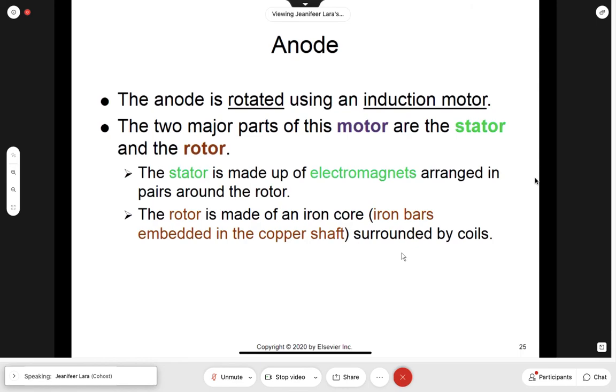So it's considered a part of the tube and also the housing, am I right? No, the x-ray tube port or the window sits inside of the housing. So I'm assuming there's also a port inside of the protective housing that goes to the collimator assembly, because that's what's happening. The collimator assembly is attached to that opening. I wouldn't necessarily call the protective housing port an item. It's just where the collimator assembly is attached. Okay, that makes sense.